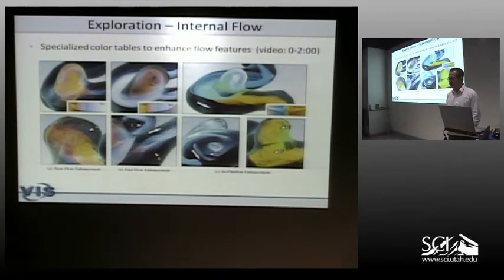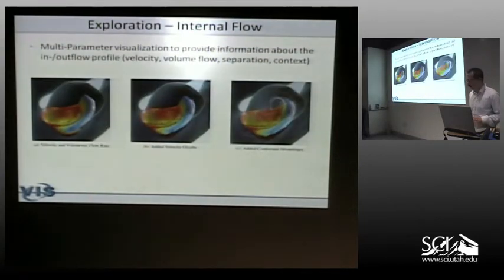Slow flow is particularly critical. If there is a lot of slow flow in the aneurysm area, that means it stays there for a longer time; higher flow would be better. So this slow flow enhancement was something which was clearly motivated by the needs of the medical doctors.